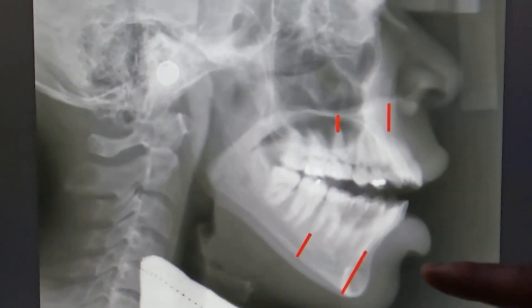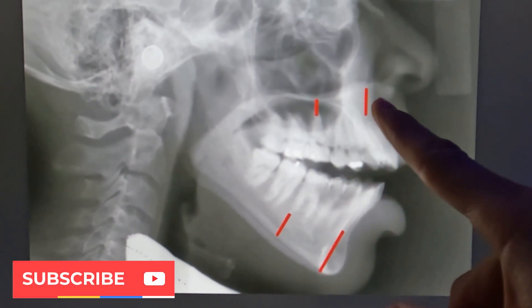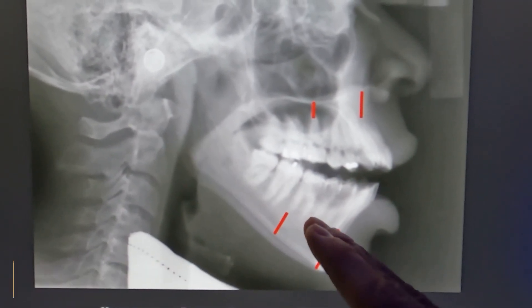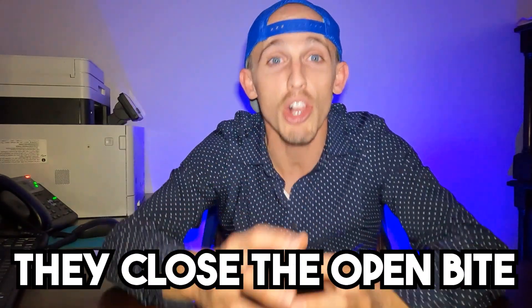Here's an x-ray of an open bite. See how this person is only hitting in the back on those teeth — here's the lower jaw and here's the upper jaw, with the lower jaw not closed down all the way. There can be different reasons why somebody gets an open bite. One common reason is when permanent teeth are still coming down — that is technically an open bite, but we know the reason why. As those permanent teeth erupt into place, they close the open bite, because teeth tend to move into position until they're touching something.